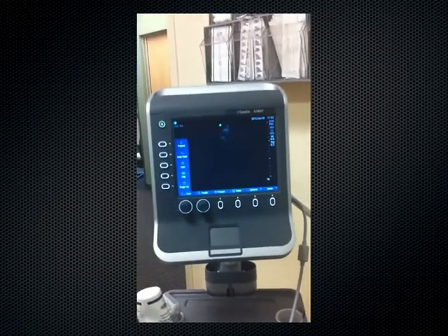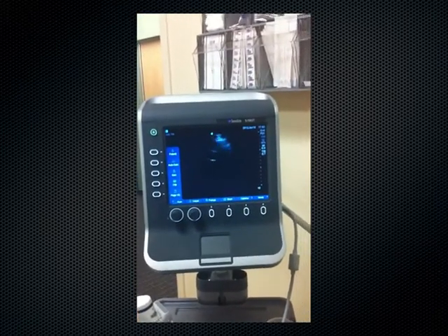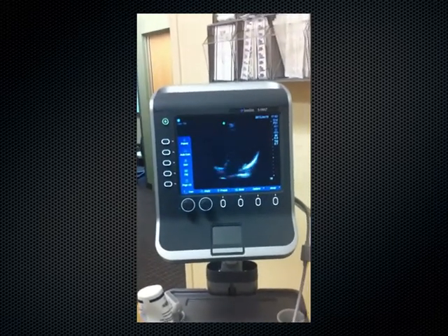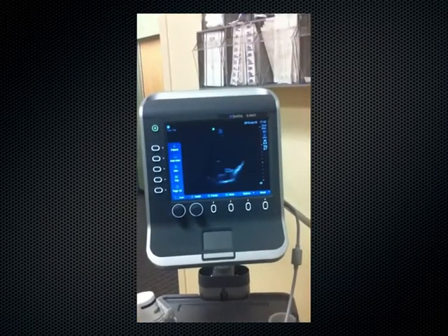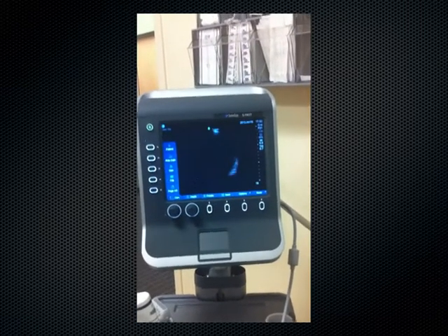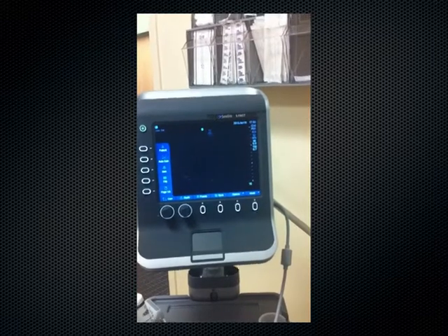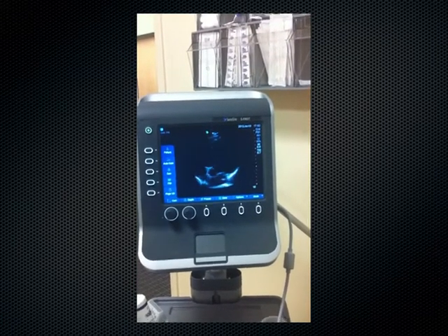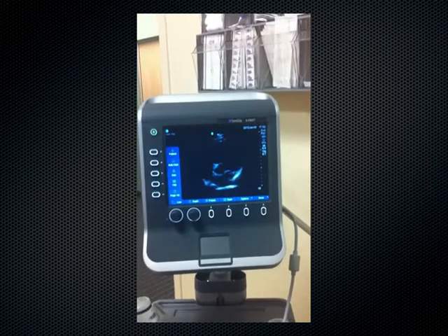I had to listen in a little bit to make sure I wasn't on. So we had the patient go left. Still on there somewhere. So we could cut out that segment where we're trying to find it. There you go. That's good. Perfect. Okay. So now continue.